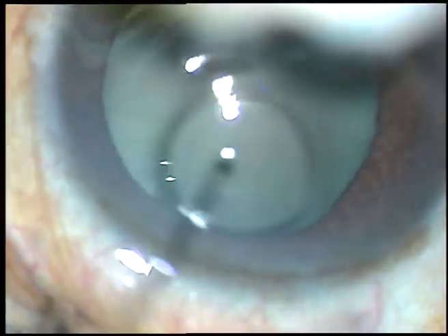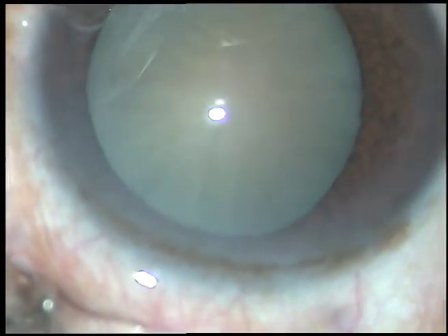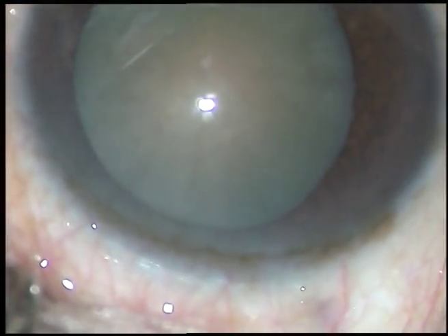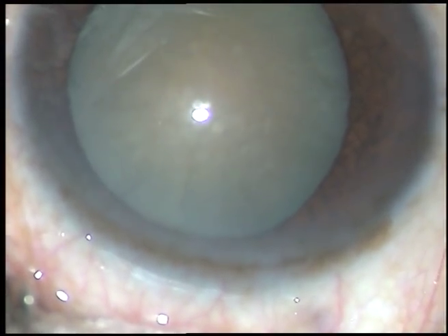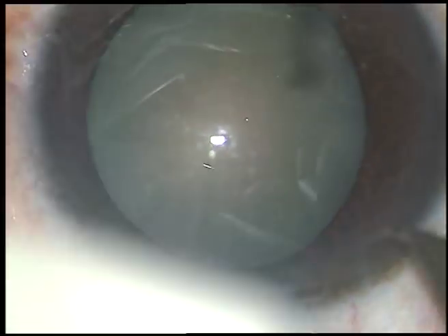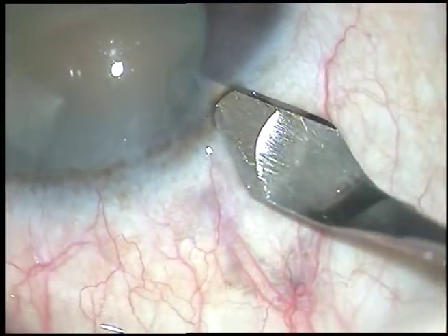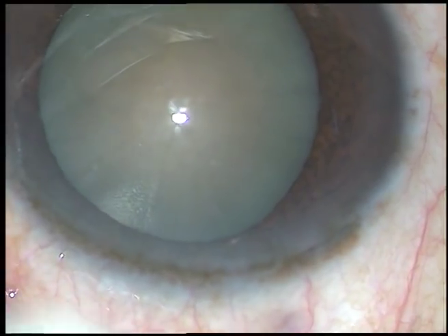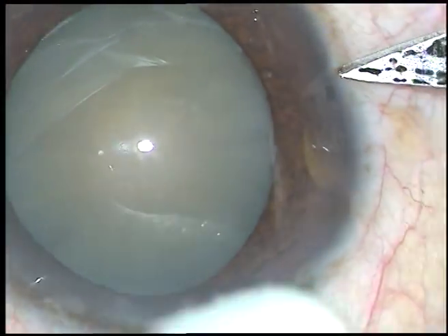Dear colleagues, this is FECO emulsification of a white non-intumescent cataract. I have taken up this case for surgery. The ocular surface has been thoroughly washed by povidone iodine and BSS. Now this is the main incision — it is a 2.8 mm incision. You can see the white cataract.